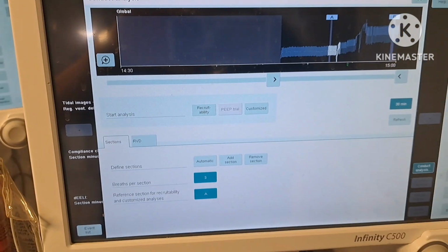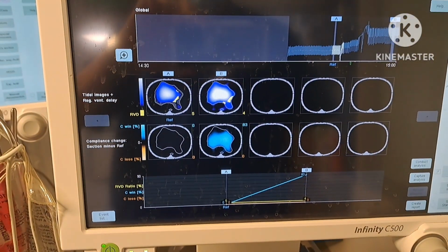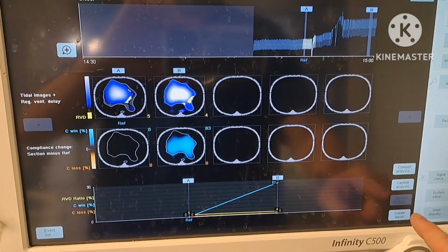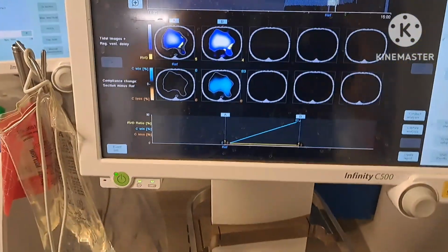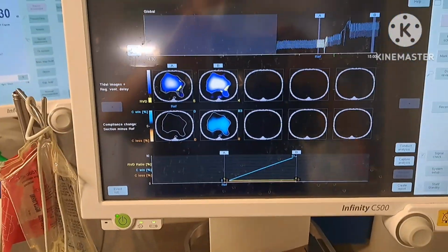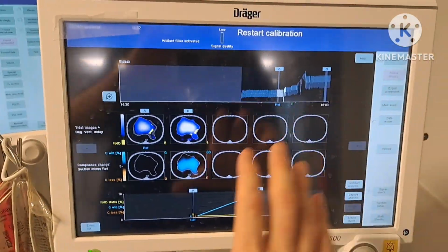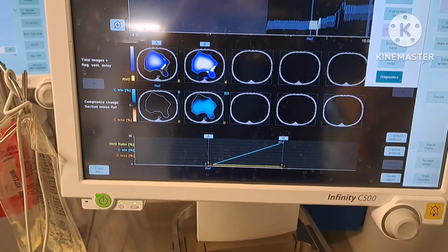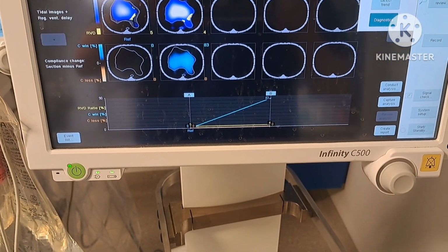And then you can also just customize. Yeah, so obviously the compliance is way better in Aprv. So we're doing this to pretty much justify step by step. We know compliance, we know distribution, and I'm going to press pause so we get some more information for you.